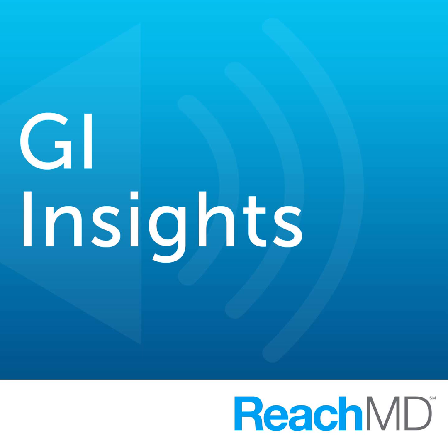But because we know that bleeding sources are often overlooked initially, that is the reason that we think second look endoscopy is very important. And so I think that in most of these situations, before embarking on a small bowel evaluation, it is important to perform what I call second look endoscopy, for sure upper endoscopy, and sometimes even a second colonoscopy.